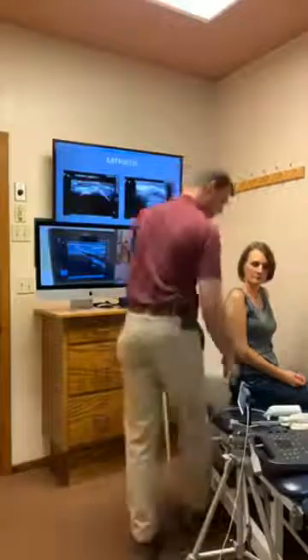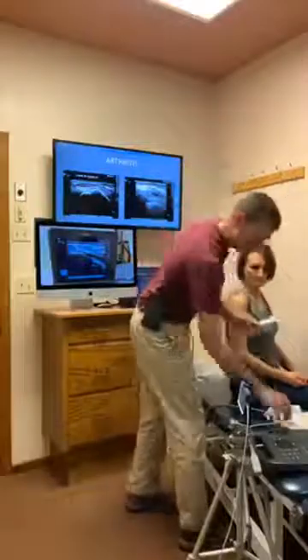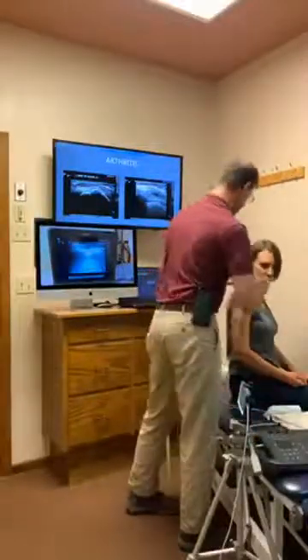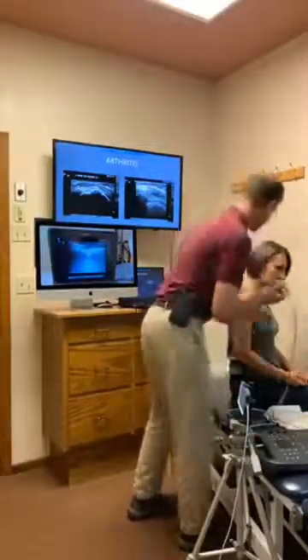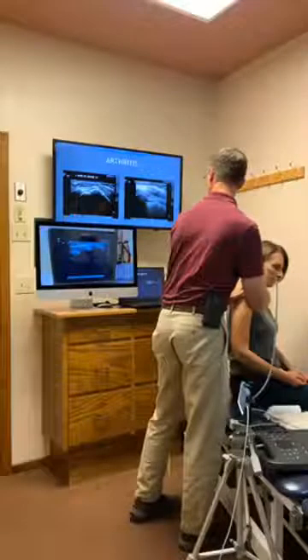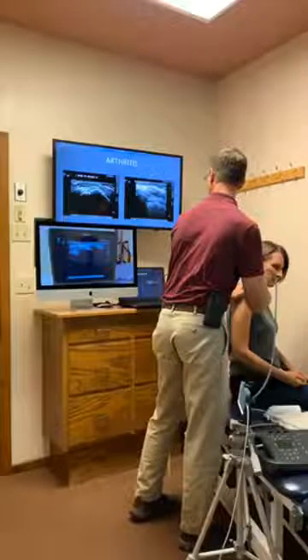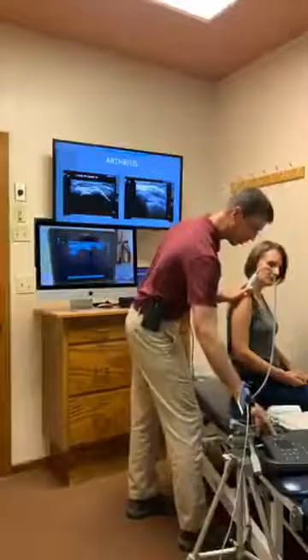Okay, so now what we're going to do is look at a joint called your AC joint. It stands for the acromioclavicular joint. It's where your collarbone attaches to your shoulder blade, if you will. All right, I'm going to go a little shallower here.